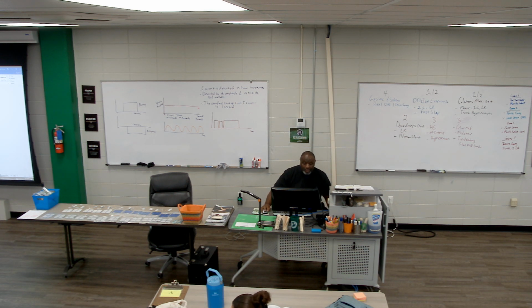So direct current, again, we already learned what direct current is. Mostly direct current will be found on some of the machines. Primarily, one of the main places you're going to find direct current is with iontophoresis machines. So one of these machines will be an iontophoresis machine, and you'll be able to look through the manual, and it should tell you the current or the waveform type it uses is a direct current.